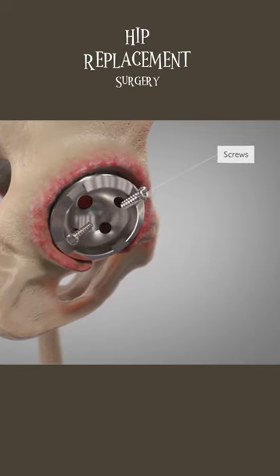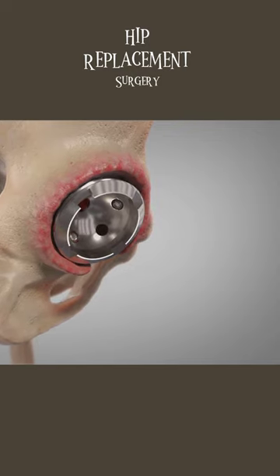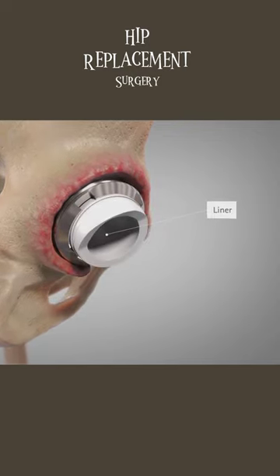Sometimes we use screws to help secure the shell until bone can grow into the metal implant. Inside the shell, we fit a new bearing surface.